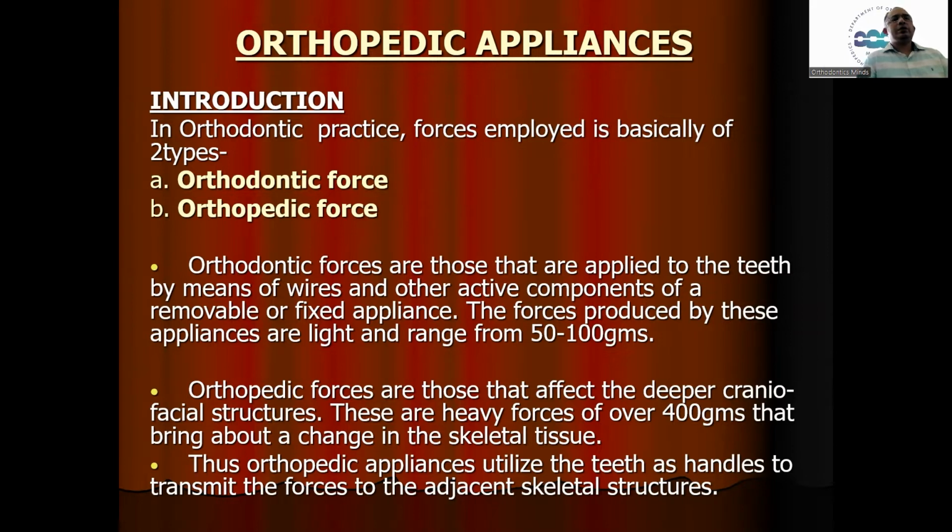And the orthopedic forces are those that affect the deeper craniofacial structures. And these are heavy forces of over 400 grams that bring about a change in the skeletal tissue. Thus, orthopedic appliances utilize the teeth as handles to transmit the forces to the adjacent skeletal structures.